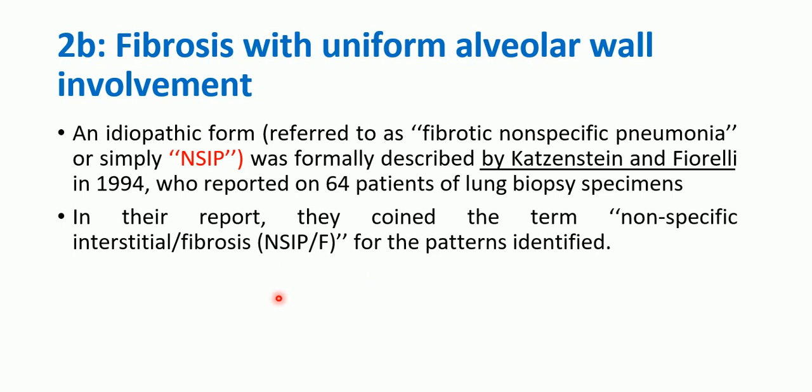So it was, as I told you, it is now referred to as NSIP. It was formally described by Katzenstein on 64 patients of lung biopsy specimens, and it was the term that was coined by them. There is another cellular form of NSIP which I'll discuss later, but to start off with, this is the fibrotic form of NSIP.